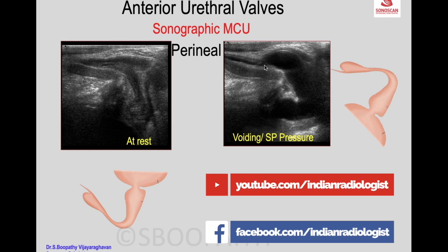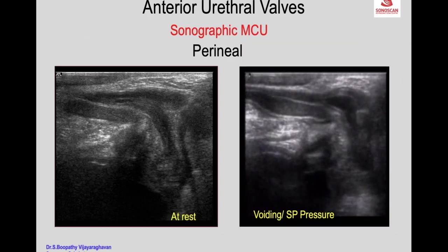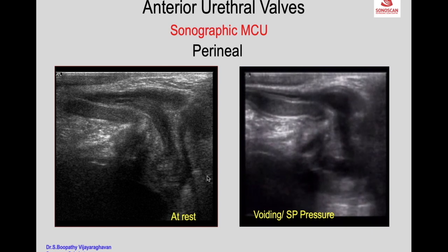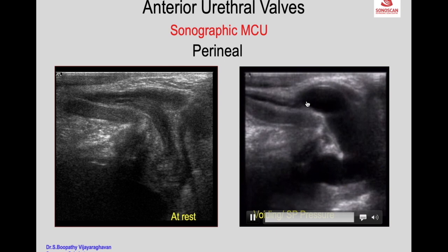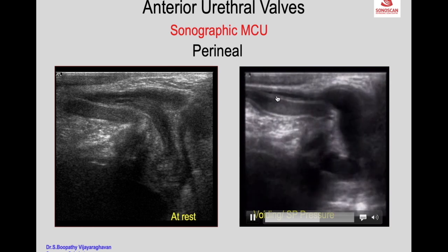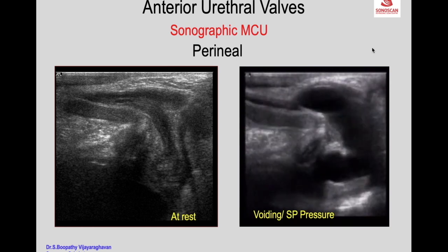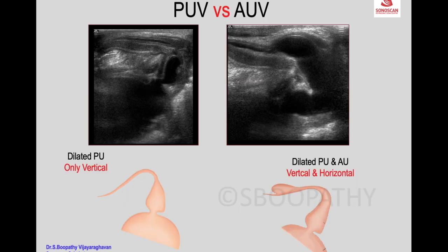The micturating cystogram confirms anterior urethral valves. The diagnosis is made by sonographic micturating cystourethrogram — a video shows the normal urethra at rest, and with voiding the dilated posterior and anterior urethra up to the diverticulum. The difference from posterior urethral valves: in posterior urethral valves, only the vertical posterior urethra is dilated and dilatation stops at the junction.